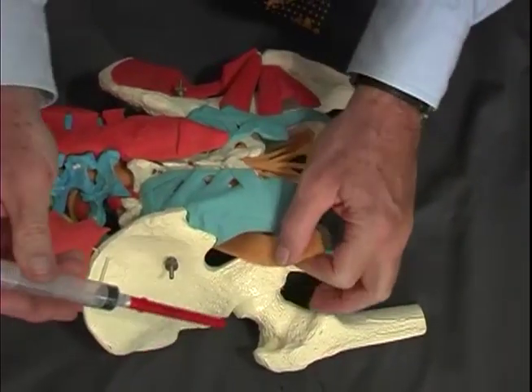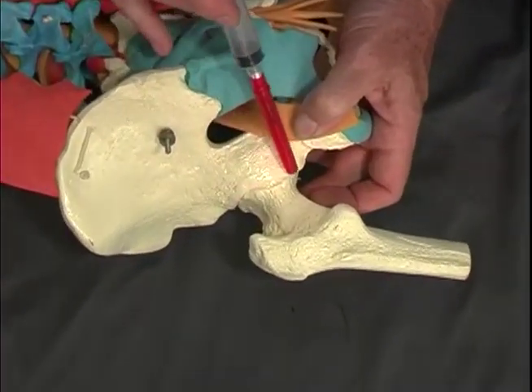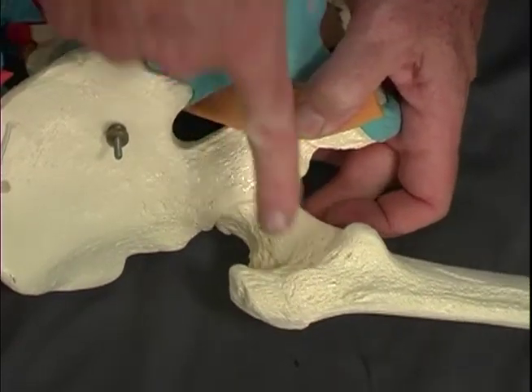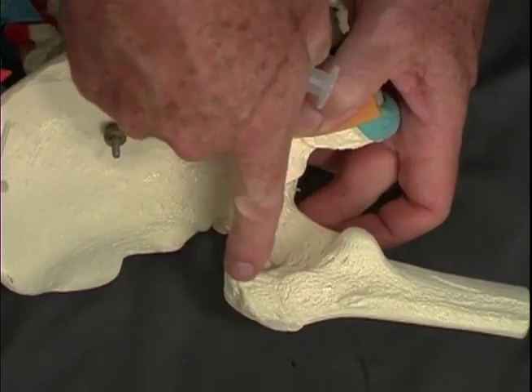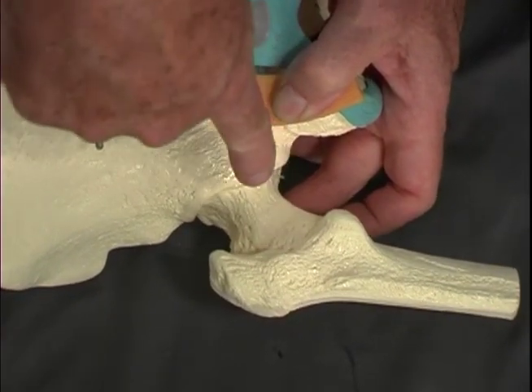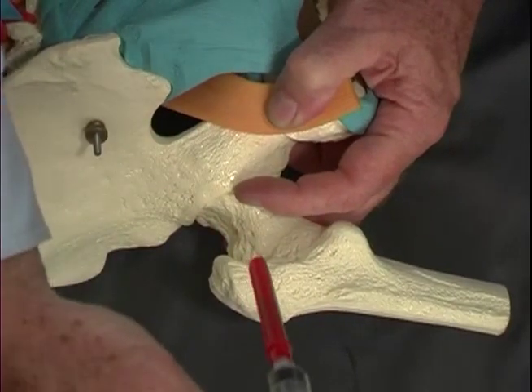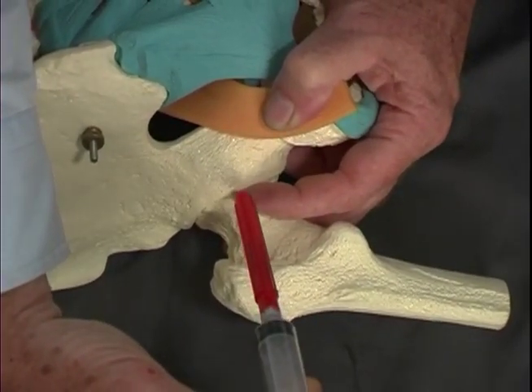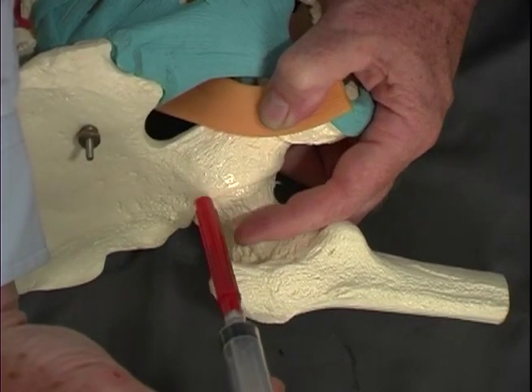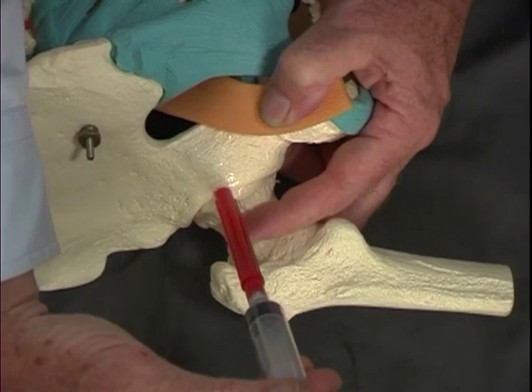We talked about the posterior capsule, and we can see here that this is the area where the posterior capsule attaches. We find the edge of the trochanter, the posterior side of the trochanter, come back from it into this depression, and we find that just medial to that, we aim our 3-inch needle down into that depression where people are tender, and we're injecting along the posterior capsule in that area.